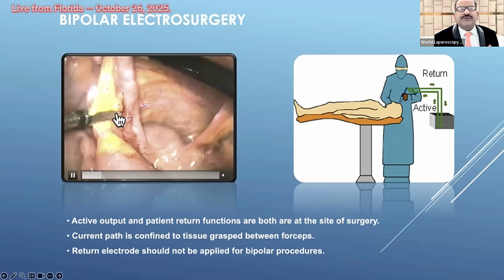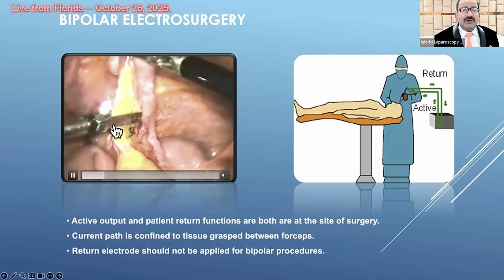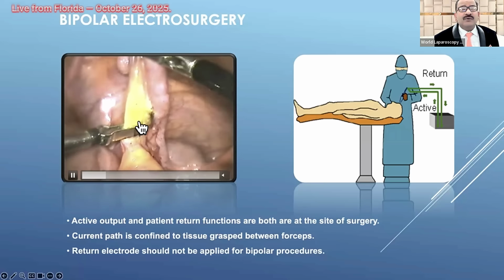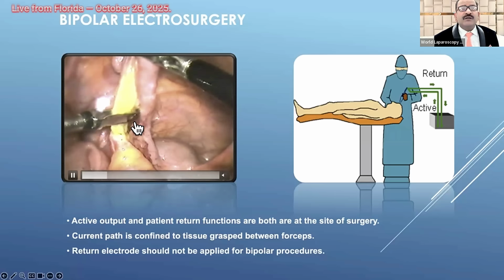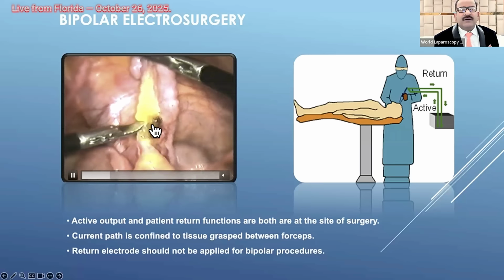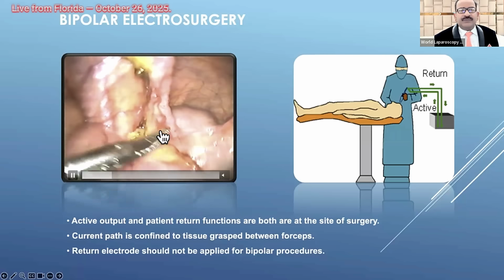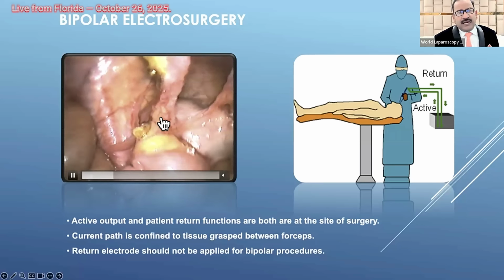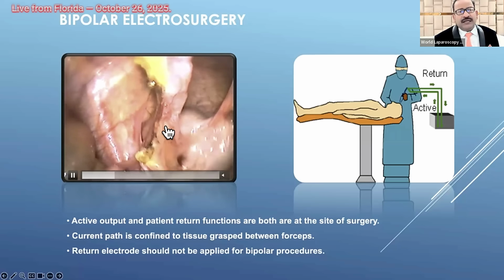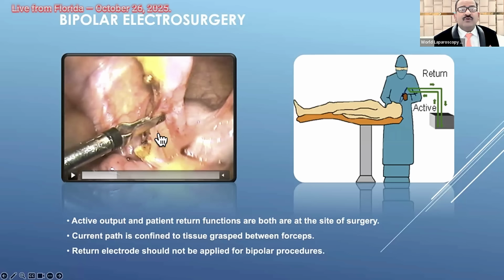After coagulation, you can see the tissue color initially becomes white, then it becomes yellow, and then it becomes brown. We should avoid the tissue becoming black. And once it is coagulated, you will see bubbling of the water, and then it is cut by the scissors, because it will not cut on its own. And again you have to bring the bipolar and again coagulate. Time here also, in one go you should not apply more than 3 seconds. Otherwise collateral damage will be more.